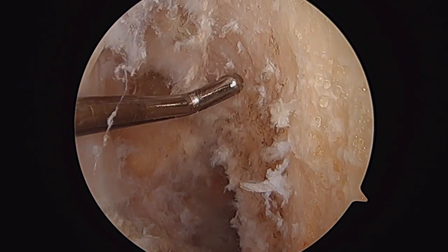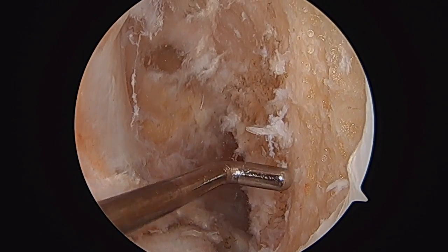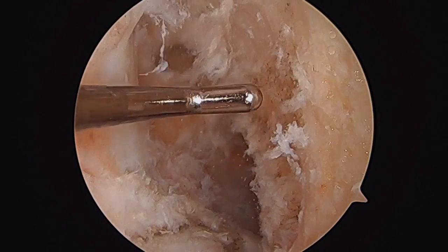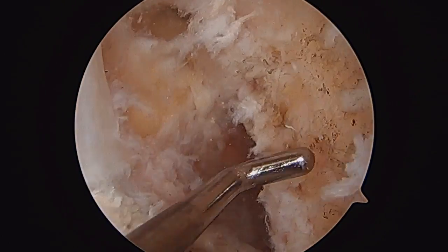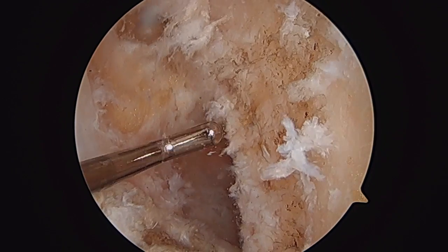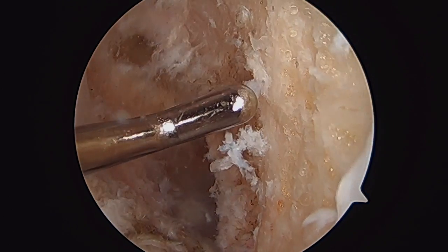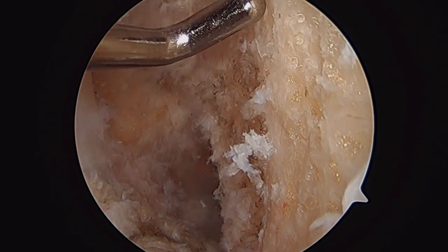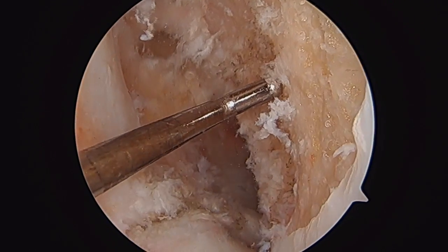Here you can see the placement of the old ACL. The top is Blumensaat's line, the resident's ridge, which often marks the anterior border of the ACL attachment, and behind that you can see the back wall. So the area between Blumensaat's line on top and resident's ridge in front is the area where the ACL lives.